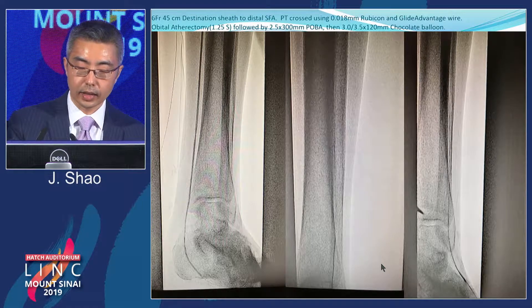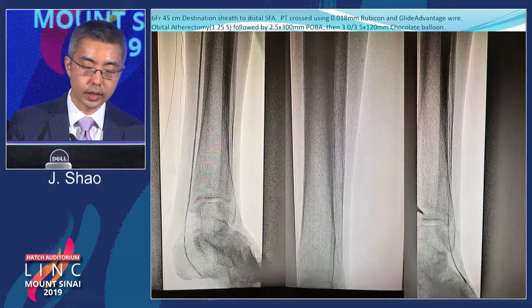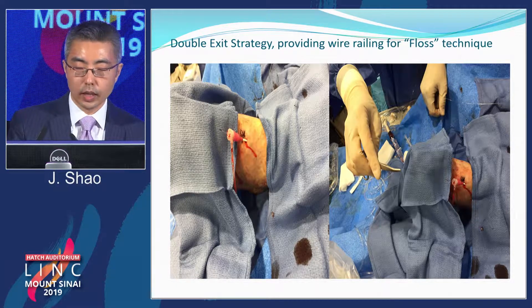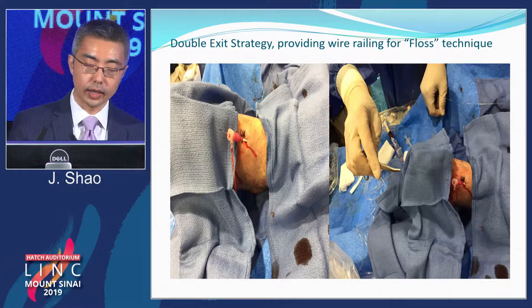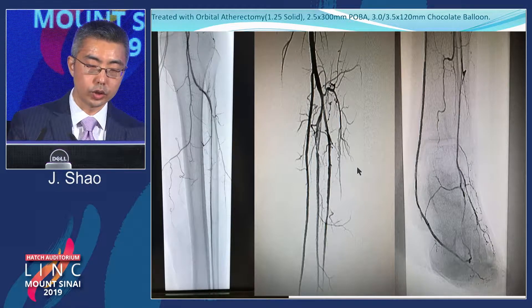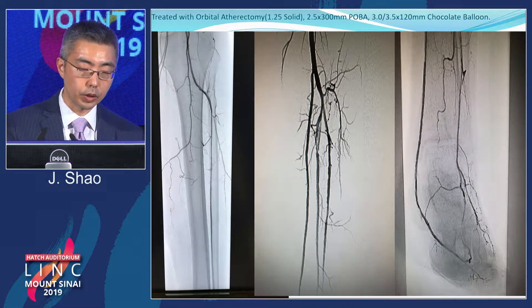Using the same wire and catheter system, I was able to cross the entire AT and get the wire externalized. The floss technique is becoming very popular, so I always try to externalize the wire on both ends of the sheath. Here the Rubicon is coming out of the pedal sheath, and I always use the Viper 475-centimeter wire, which gives a really good railing — pretty much allowing you to deliver any balloon or stent as far down as you want. The AT was treated with atherectomy and balloon angioplasty as well, and here you can see three-vessel runoff with good PT and DP into the foot with a pedal loop for good outflow.